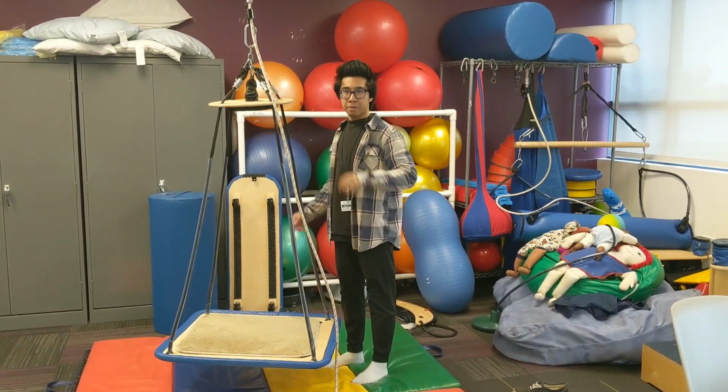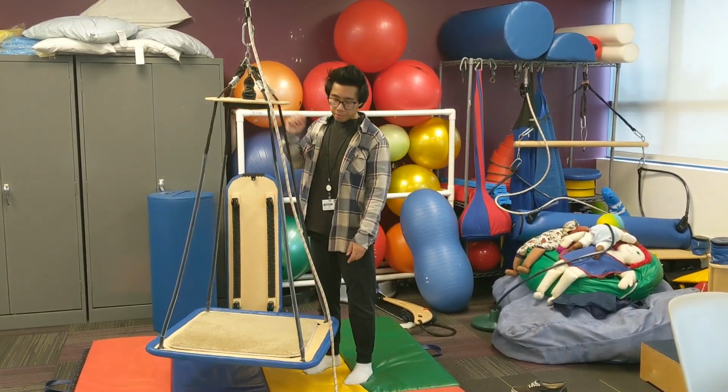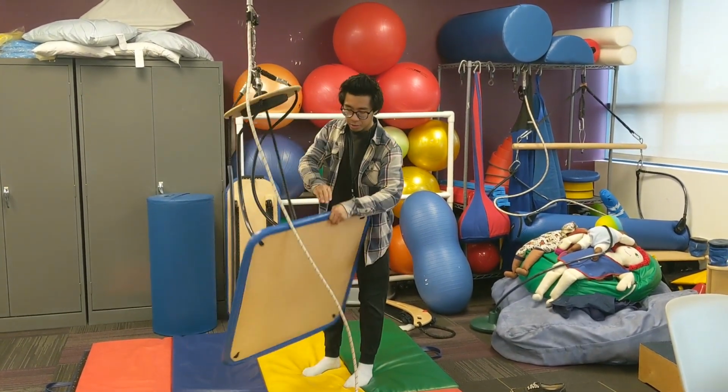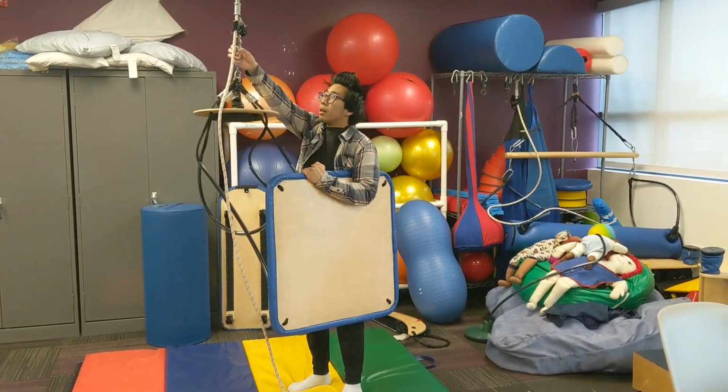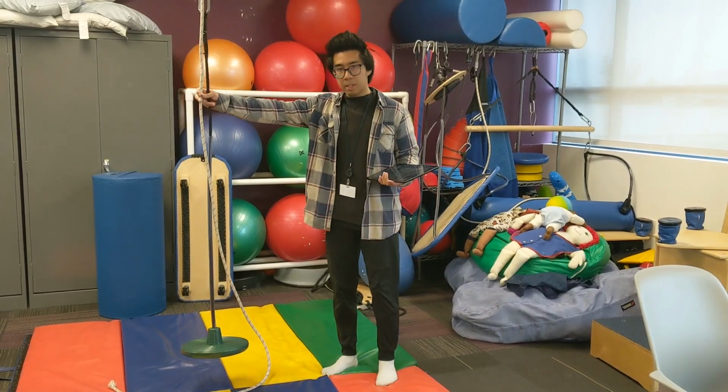One more thing, just be mindful that this platform swing does have a weight limit of 300 pounds. To remove it, to use proper body mechanics, you're just going to grip it here, and then latch it. So this is called the disc swing.